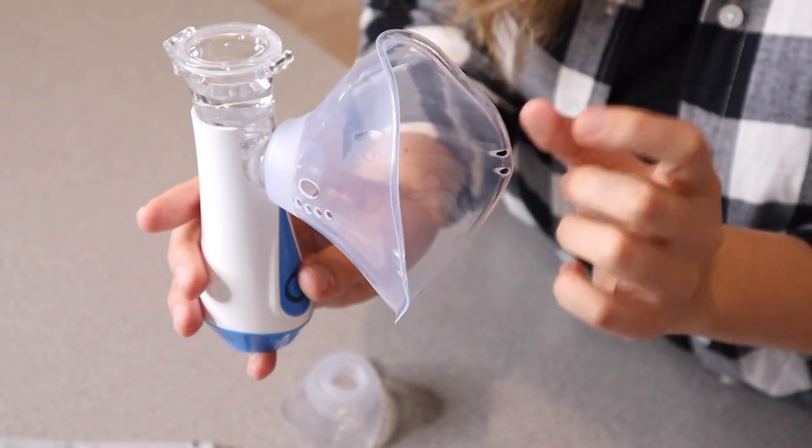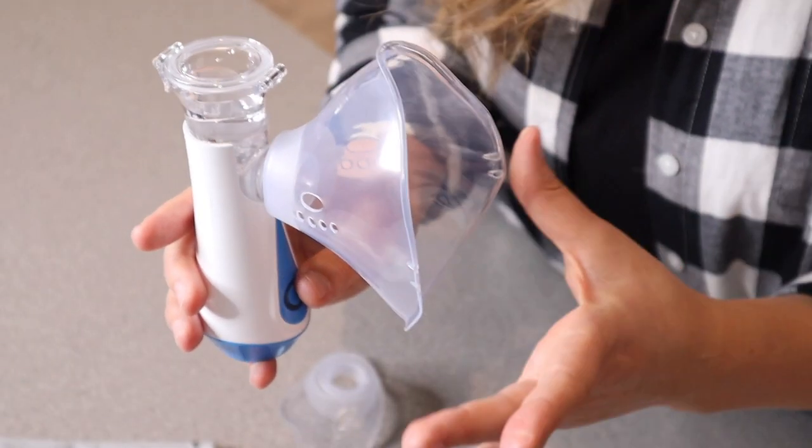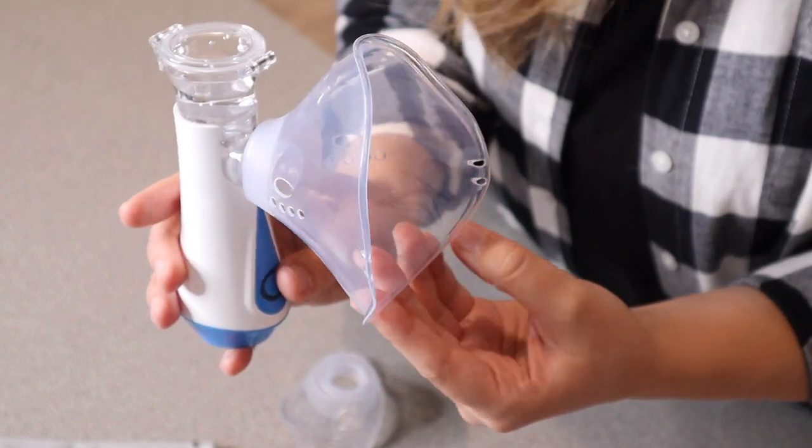I think that it's really neat that this has five times fine atomized particles, just meaning that this has a powerful nebulization performance.